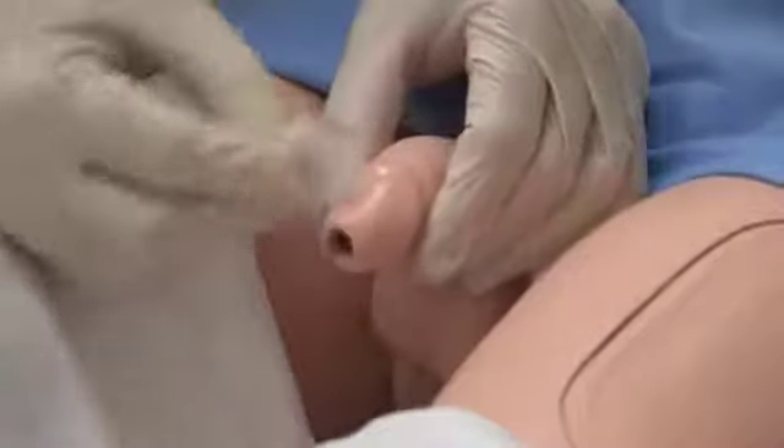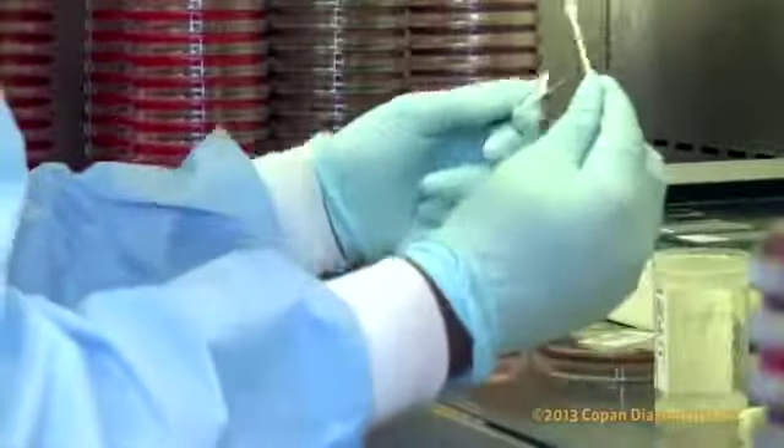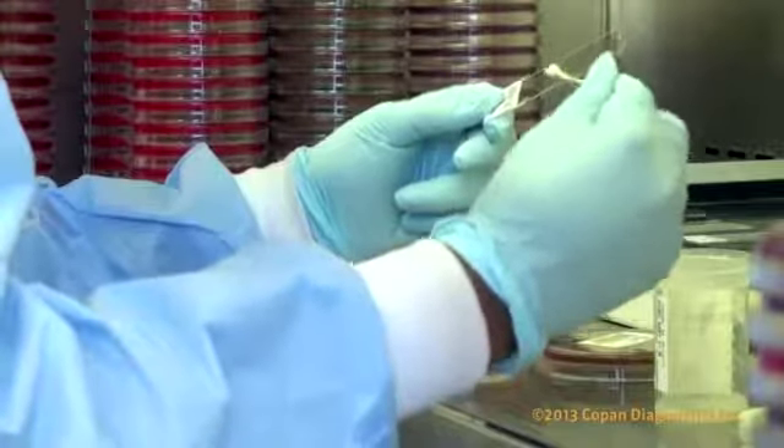In males, clean the glans of the penis by wiping from front to back using a soaped pad or a commercial skin cleanser. If exudate is available, express exudate from the urethra and collect it on a regular-sized swab. Additional exudate can be collected to make a smear on a glass slide. In this case, roll the swab over 2 to 3 centimeters of the slide surface and label the slide correctly.